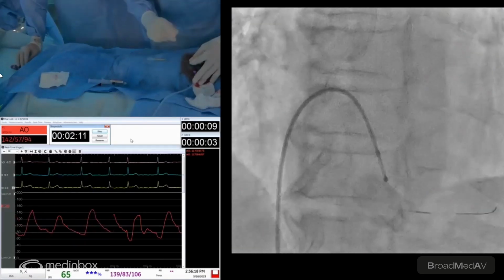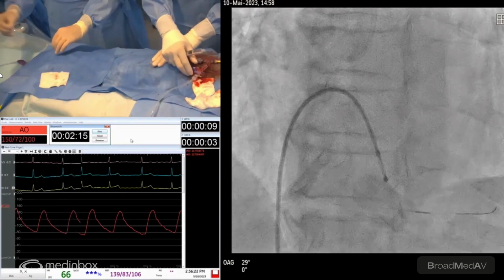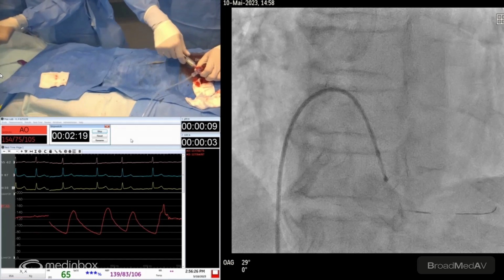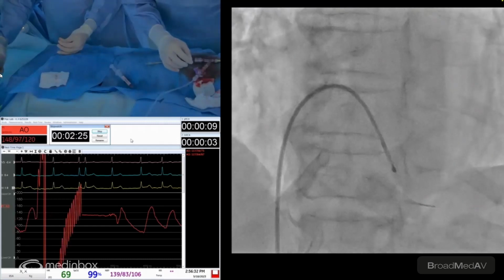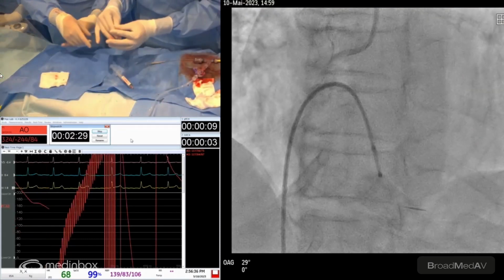Ready. Okay, you can take away the microcatheter, the wire. Removing the wire, going to put back the workhorse. We'll give some nitro for the distal spasm a little bit. One of nitro. Let's push that. There you go. Can we prepare the IVUS, please?